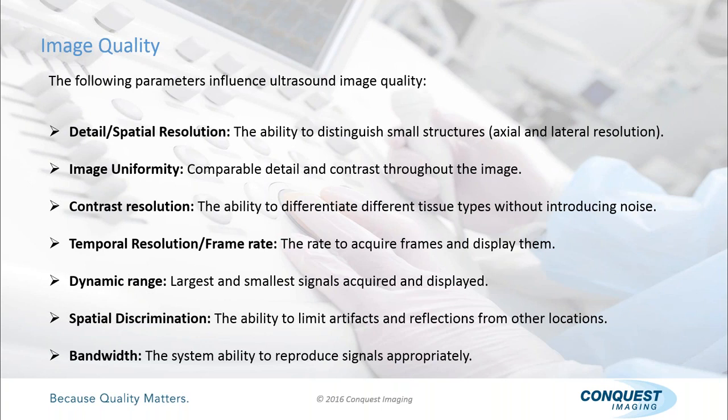Contrast resolution. The basic definition is the ability to differentiate different tissue types without introducing noise. Again, we'll show you examples of these, but really contrast resolution is the ability to take different density materials or structures in the human body and show them on the screen in a way that allows you to differentiate them.